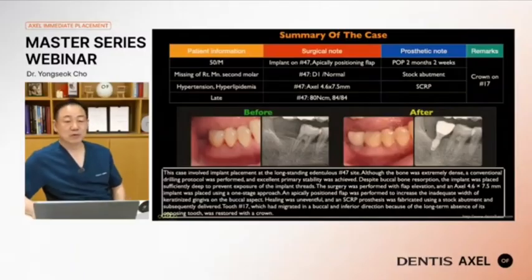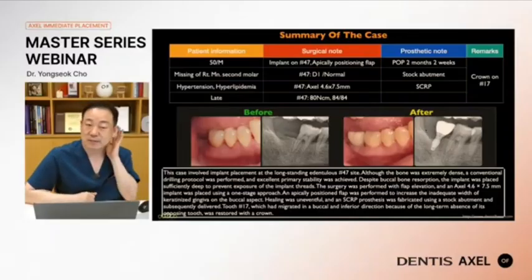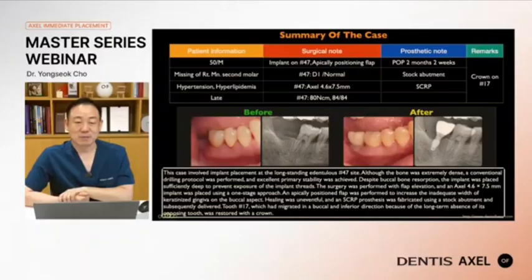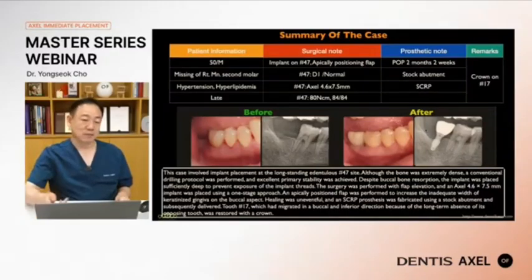Okay, this is my routine for a number 7 implant case, the late implant case. Sometimes I ignore keratinized tissue and do simple flap surgery, but when I have enough time, I do an angular flap and try an apically positioning flap. Apically positioning suture is not so difficult, but you need some technique for this.